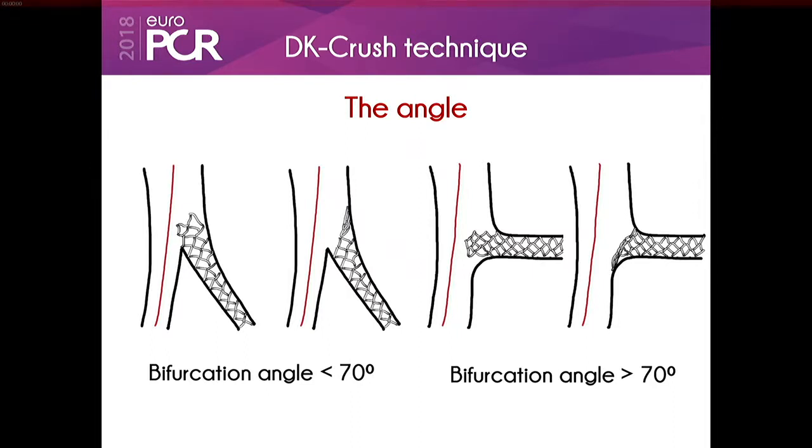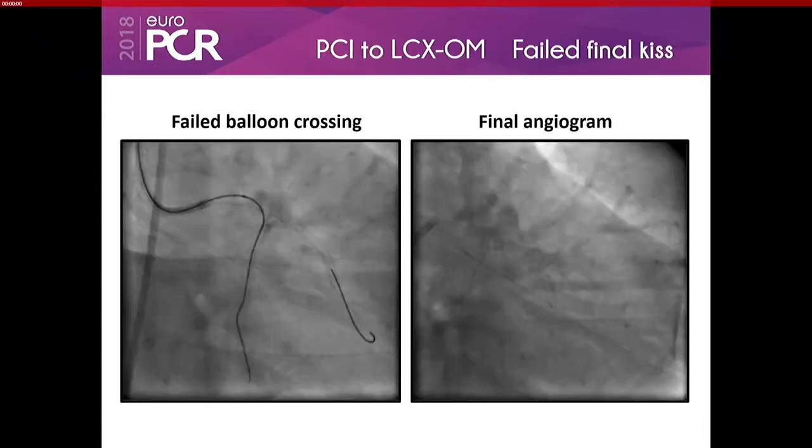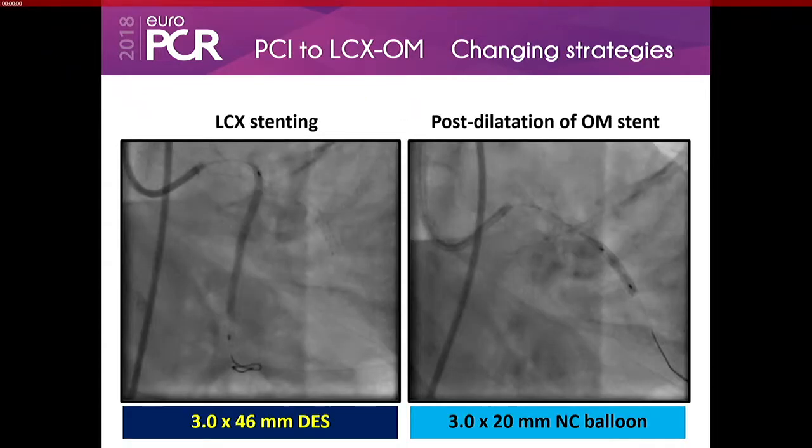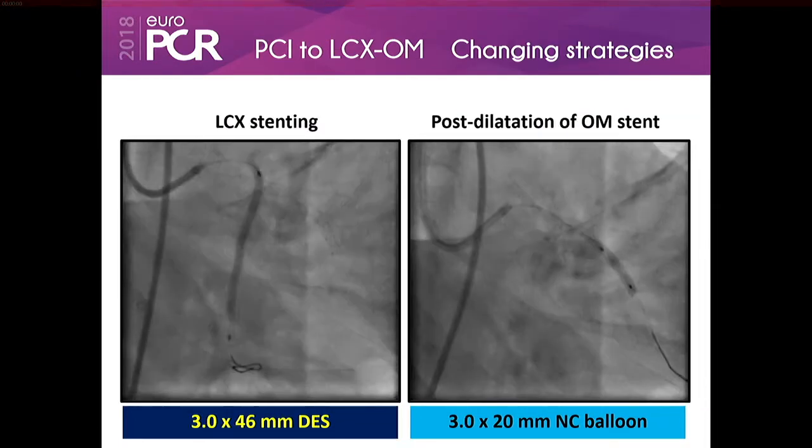What size of stents are you going to use if you are going to use a culotte from side branch into the main branch? Go back to the image. So what size stent would you use if you were going to use a culotte? Yeah. Normally you size to the distal vessel, and you can always pot in the proximal vessel.